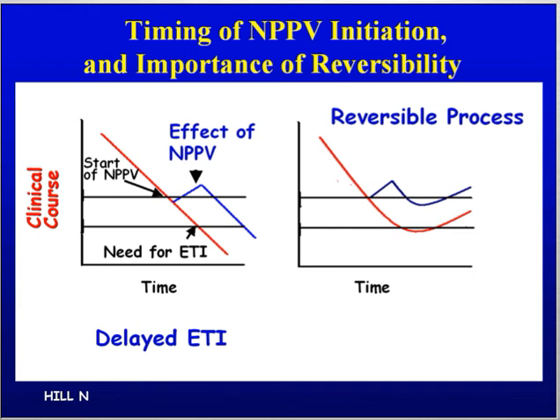One short question for me. You said that we didn't make any tremendous advance over the last 5-6 years, neither in understanding, neither in interface, okay, some. So how do you explain this absolutely impressive increase in non-invasive ventilation? I think it's a very interesting and exciting question. Why some progress in medicine takes years or decades to go into clinical practice, and why this was so widely accepted.